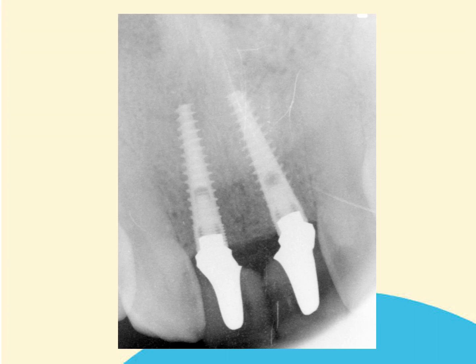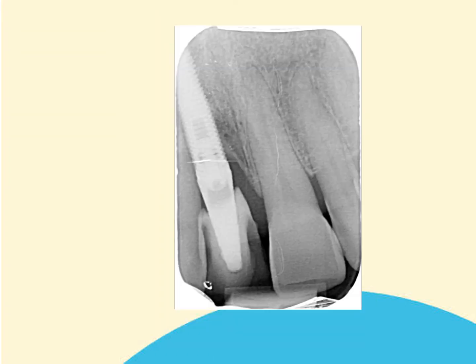Another example again of EasyPlants, tapered implants, quite aggressive thread form. And the abutments in this case are slightly larger than the 3.75 diameter implant, again indicative of a series 2. And again, look at this taper leading into the implant and short hex. These are all features of the series 2 connection. Again, a feature which is indicative of a series 2 or an earlier design is that the implant is completely flush with our abutment, and there is absolutely no gap between the implant interface. So this is a series 2 or EasyPlant type connection.